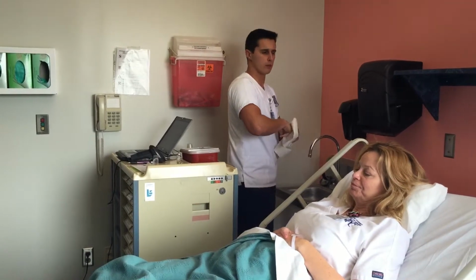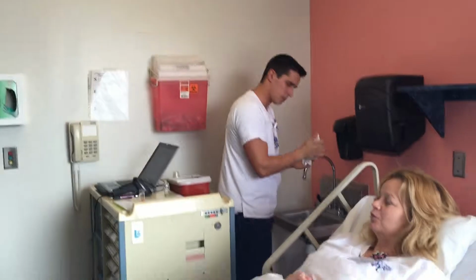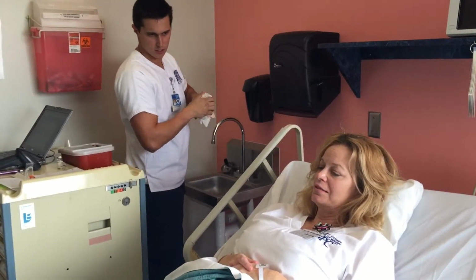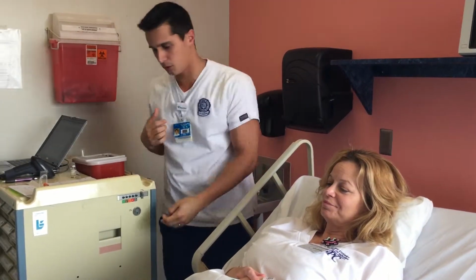You had a sugar of 190, 290? Today it was 290. Yeah, 15 minutes ago when the tech came in and checked. Yeah, so your doctor has ordered that we give you 16 units of regular insulin. Okay. All right. That sounds good.